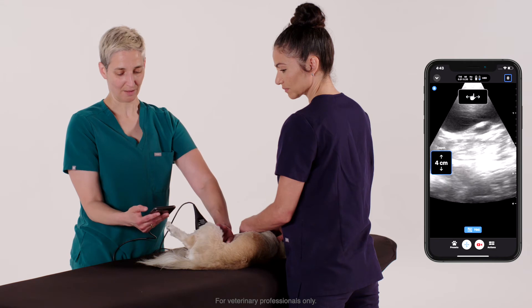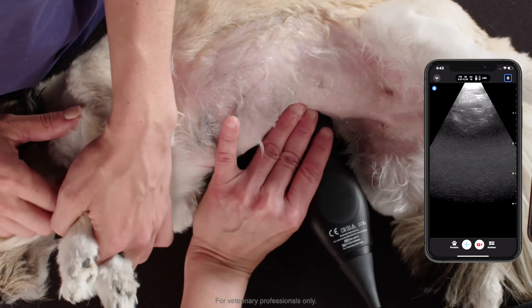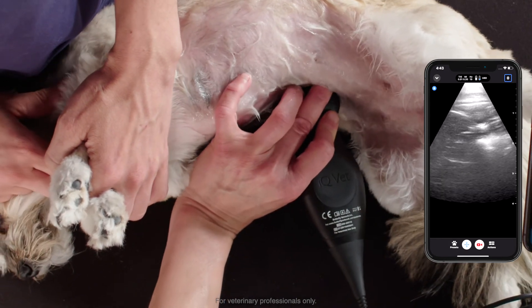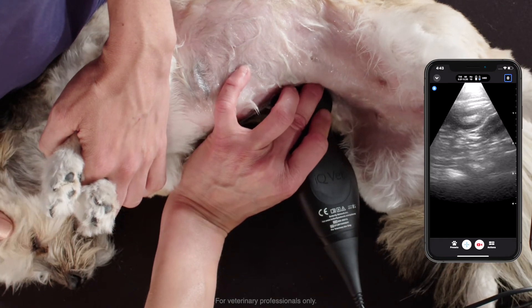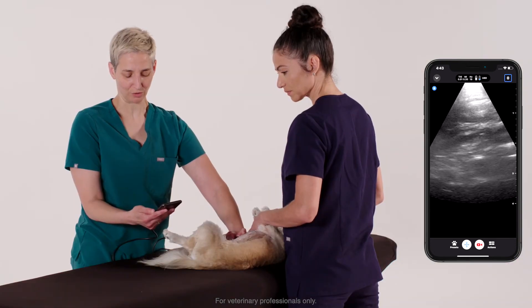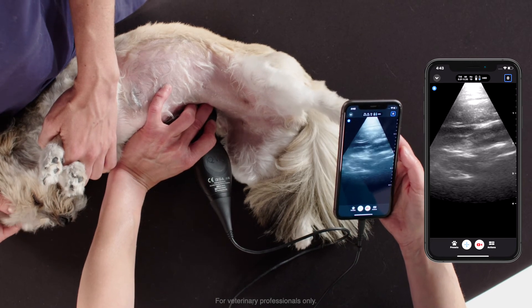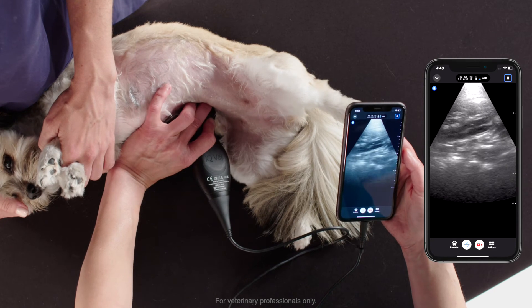Zooming back out again, I'm now going to bring the probe towards the table into what we call a gutter of the abdomen, really looking for any evidence of effusion collecting in the most dependent area of the dog, which is going to be the ventral abdomen. Here you might get some gut in view, some intestine, and you could examine for evidence of good peristalsis, making a note if there's any obvious signs of ileus.